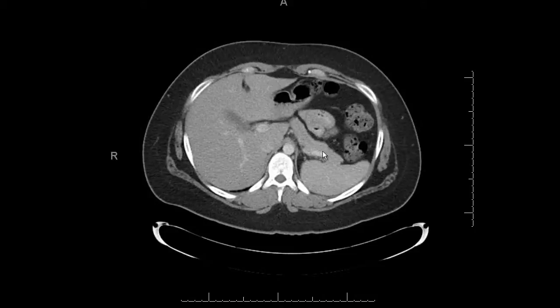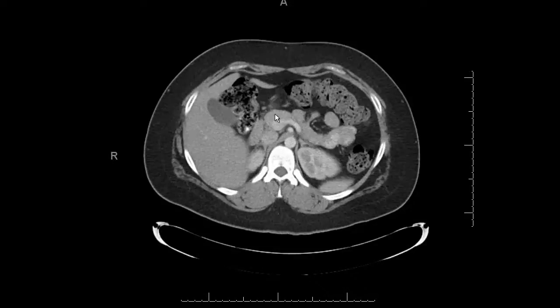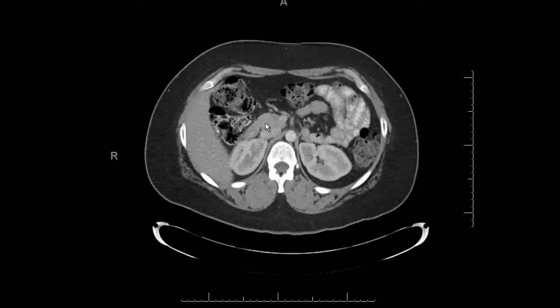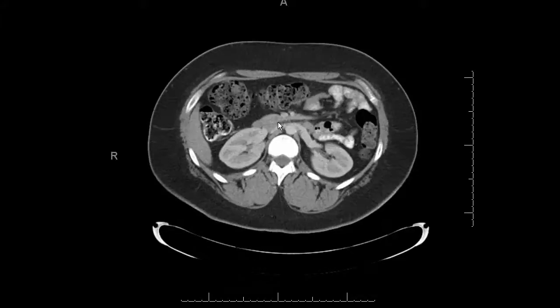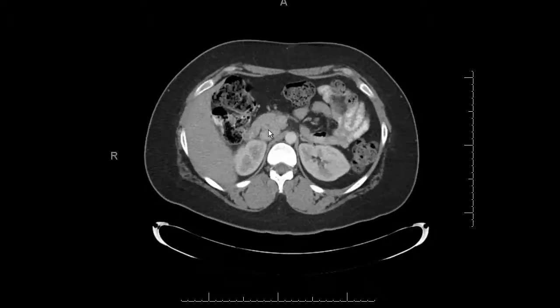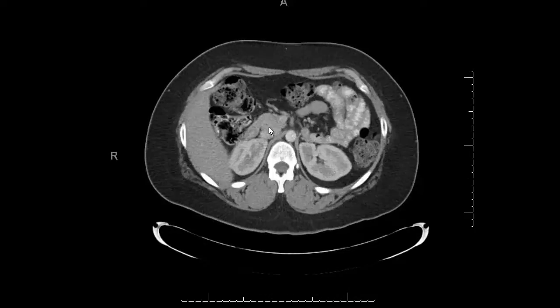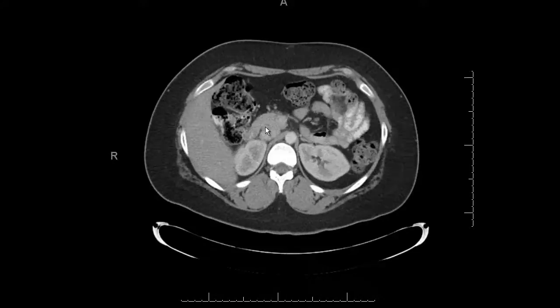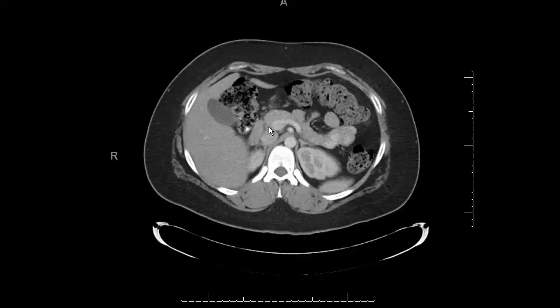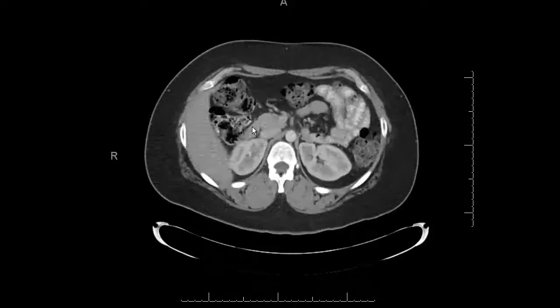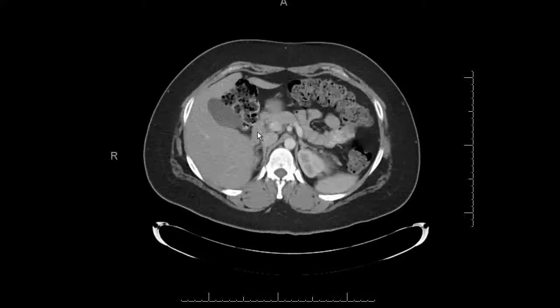Then I look at the pancreas. If you're having trouble finding it, start at the splenic hilum to find the tail of the pancreas, then follow it back and scroll down to the head and uncinate process. You also want to find the common bile duct — it's a little tough to see, usually found in the head of the pancreas as a small dot. Often you can follow it back up to the gallbladder.